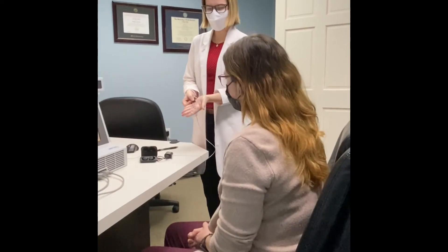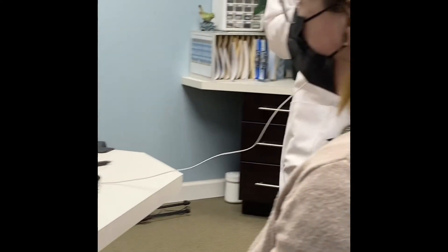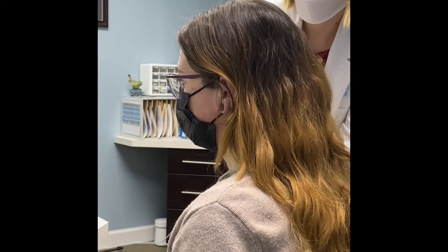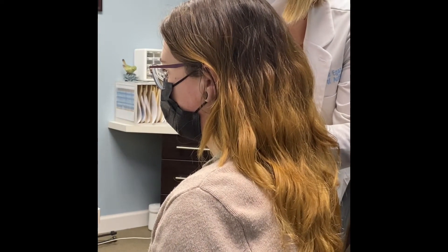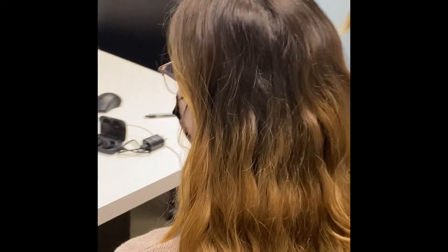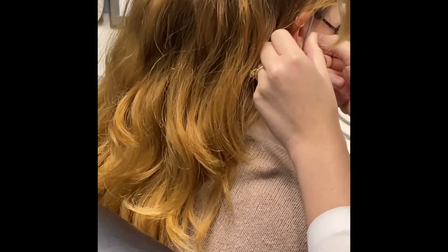I'm going to use our real ear measurement system. This is our measurement microphone, and I'm going to put that in her ear. And then we're going to put the hearing device in her ear. You're going to feel this kind of wiggle as it goes in your ear.